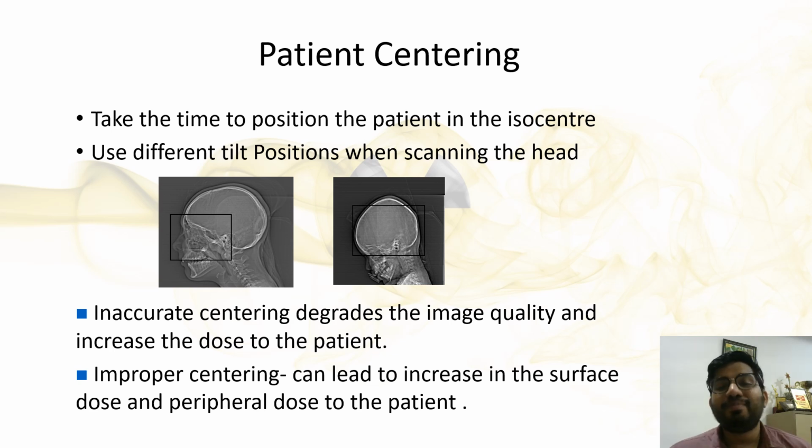So we'll move on to patient centering. Don't be in a hurry, don't position the patient hurriedly. Take the time to position the patient in the ISO center. You will get better image quality and speed up your post-processing times.